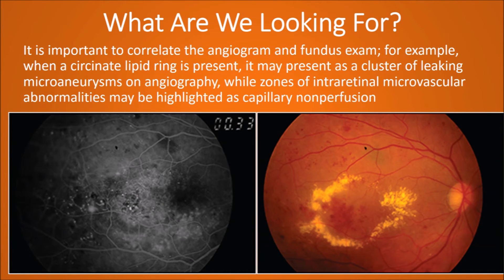It is important to correlate the angiogram and fundus exam. For example, when a circinate lipid ring is present on fundus examination, it may present as a cluster of leaking microaneurysms on angiography, while zones of intraretinal microvascular abnormalities may be highlighted as capillary non-perfusion. We should not mistake hyperfluorescence on angiogram due to window defect — because of RPE atrophy or old laser treatment — with leaking microaneurysms. This can be avoided by careful fundus examination and history collection. However, OCT can be very helpful in such cases to rule out central macular thickening.